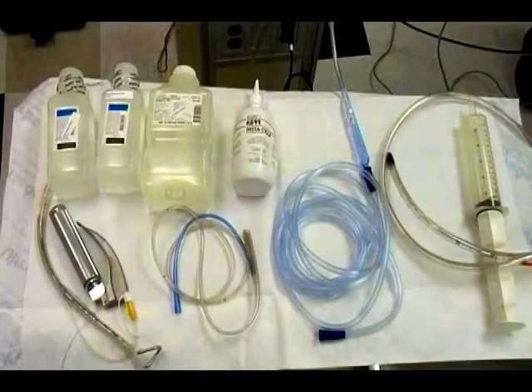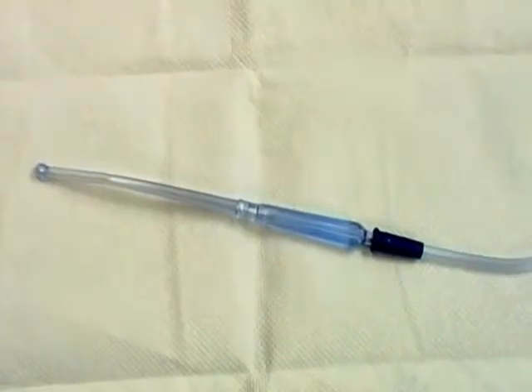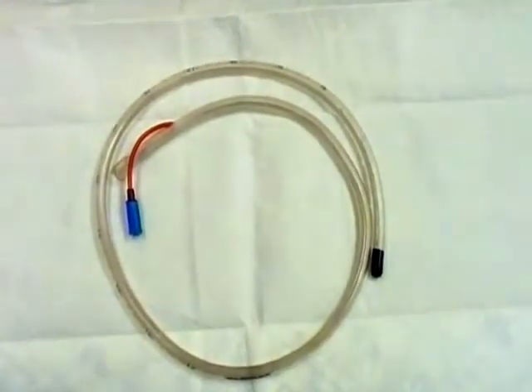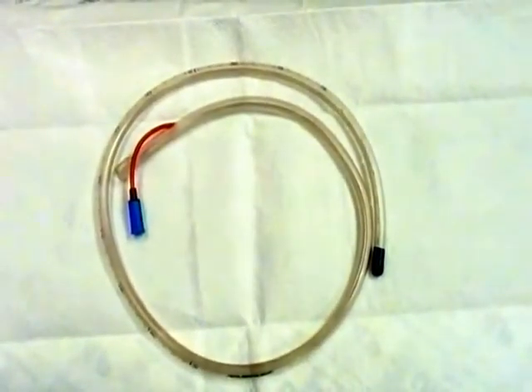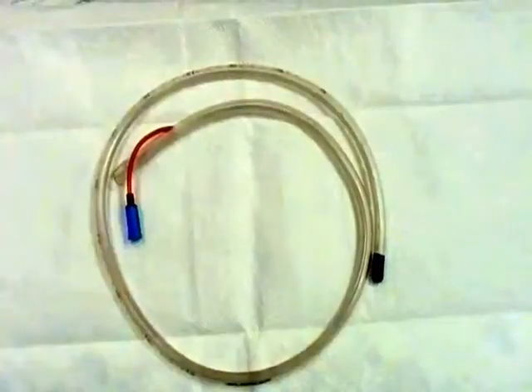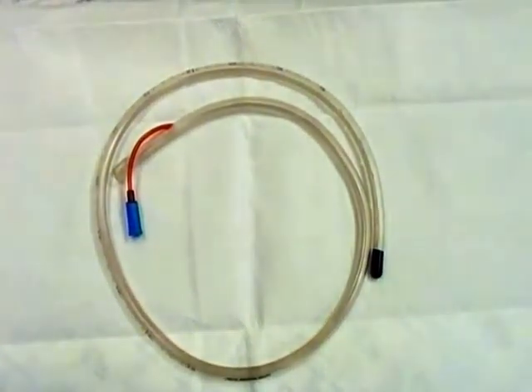As with any procedure, you want to have your equipment set up before you start. You will need suction, intubation equipment, an ET tube stabilizing device, a large bore OG tube, 36 to 40 French in adults, 24 to 28 French in kids. An NG tube can be used with liquid ingestions but otherwise is not large enough. Go big or go home. For the patient's sake, have a jelly lubricant for the OG tube.